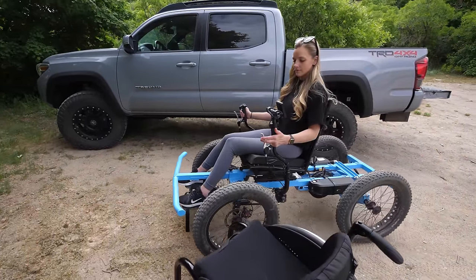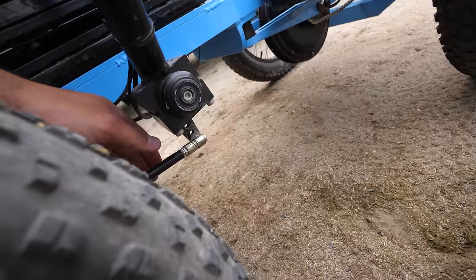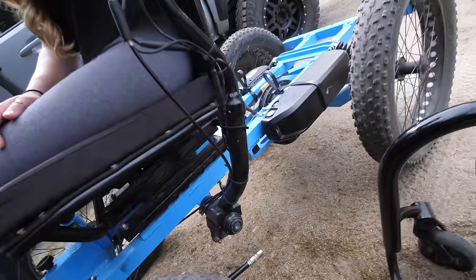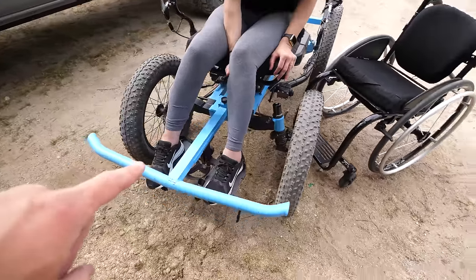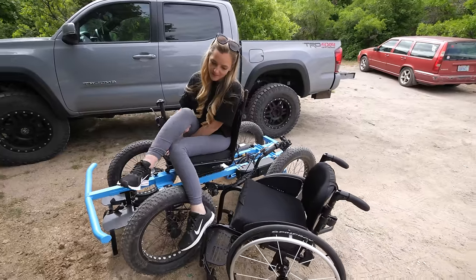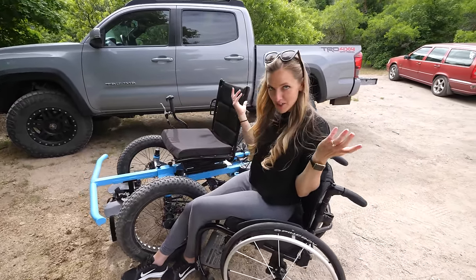You might be asking how Cambry gets in and out of the chair — it's actually pretty easy. Down here at the bottom there's a little latch that I can unclip, and the handle tilts totally backwards. Cambry can grab her chair, undo her feet from the little velcro things, pull her legs over the wheels, and then voila, she's in the chair.